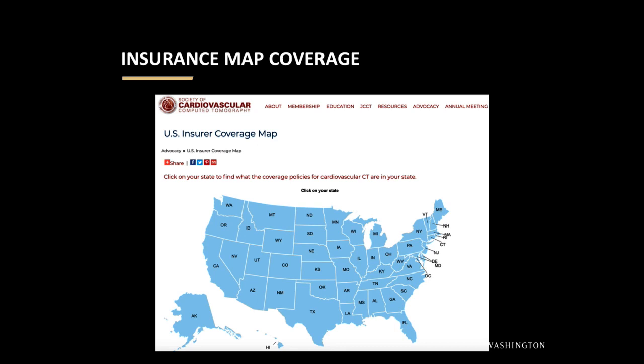That's a good question. I think there's more that goes into it. The question is, can we figure out or predict if the patient is going to have a lot of calcium that will affect the scan? I don't really know if we can just use age as the cutoff. There are probably other factors to take into account to predict that.